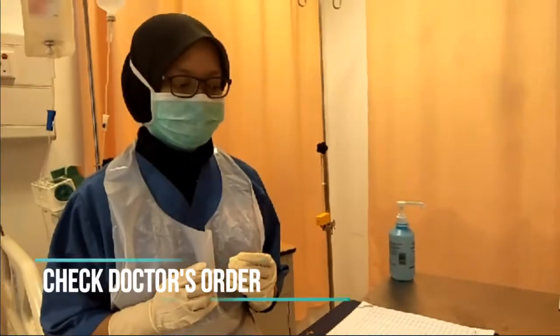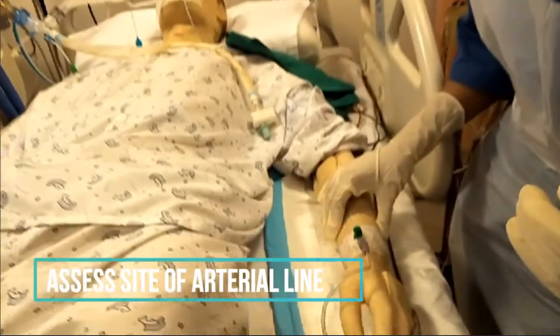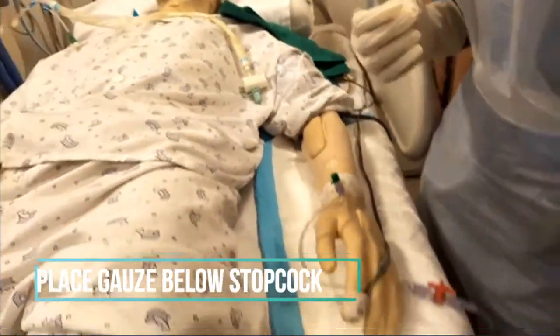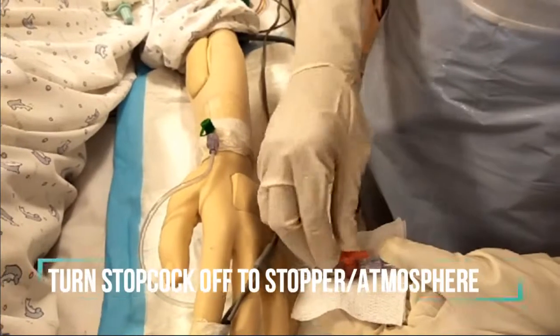First, check doctor's order. Next, assess the site of arterial line. Place the gauze below the stopcock. Turn stopcock off to the stopper.